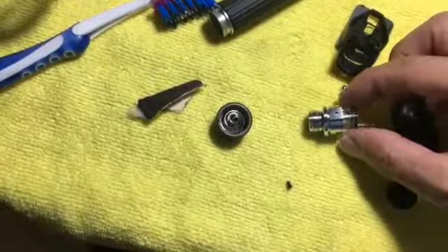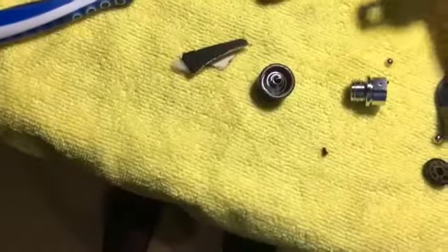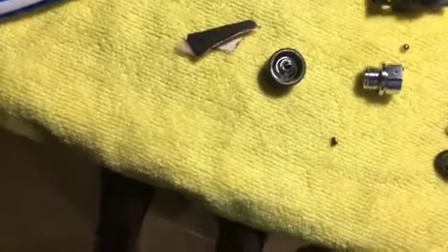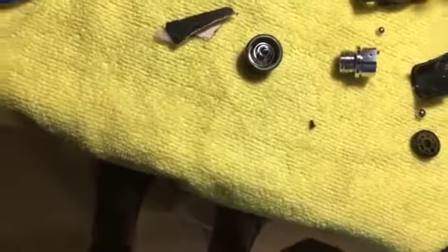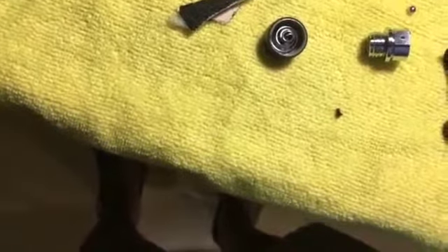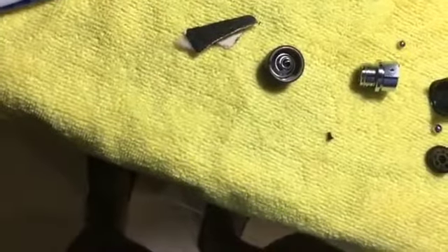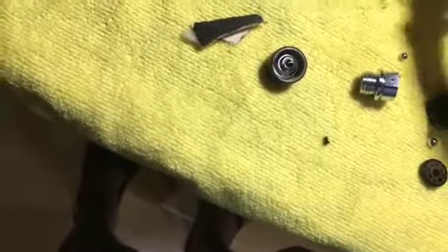Basically those are the parts. You have some springs — a couple of springs. You have a spring that holds the assembly together, and there are two sets of springs as well as two sets of ball bearings.